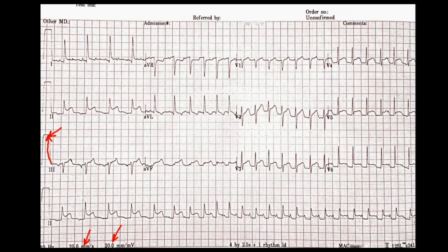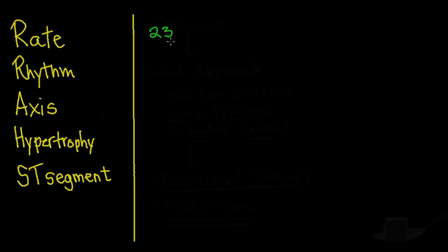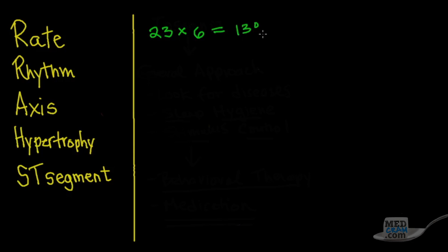We can simply count up the QRS complexes — 1, 2, 3, 4, 5, 6, 7, 8... 21, 22, 23 — and multiply that by 6. So if we have 23 QRS complexes and multiply by 6, since there are six 10-second periods in a minute, we get something close to about 138 beats per minute. That would be the average for the whole EKG.